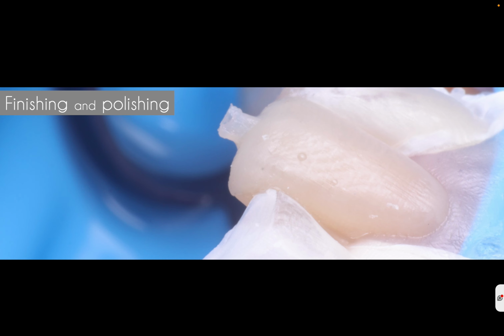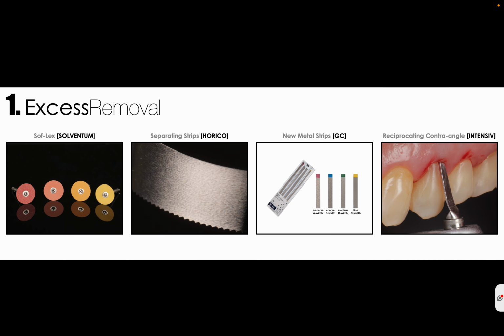Finally, once you have done the technique, you obtain something like that, a lot of excess in the interproximal, gingival aspect. So what we need to do, first of all, is improve the shape with some disc, and then break the contact points with metallic strips.